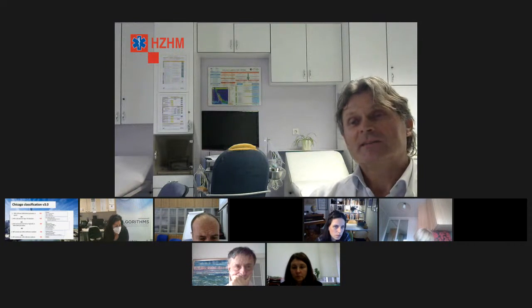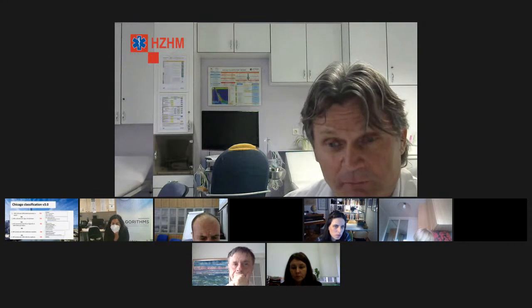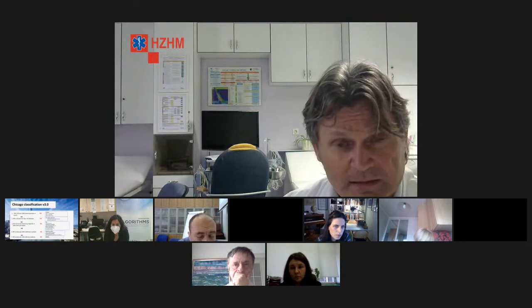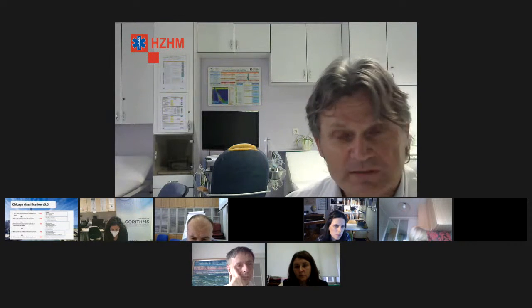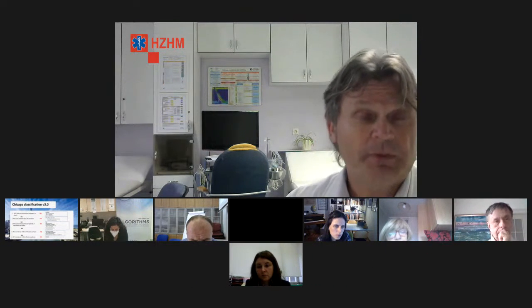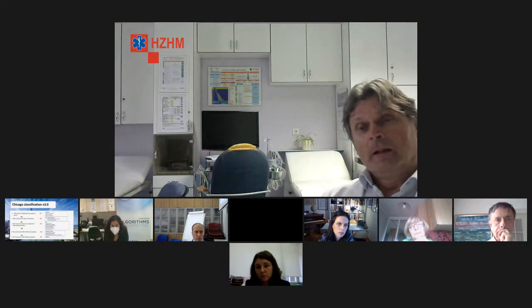Solid state kateteri su isto lijepa priča. Navodno se na zapadu ne radi sve sa solid state kateterima, to je negdje oko 50% pretraga prema informacijama kad smo bili u Nizozemskoj.